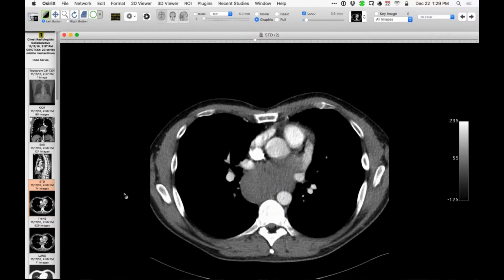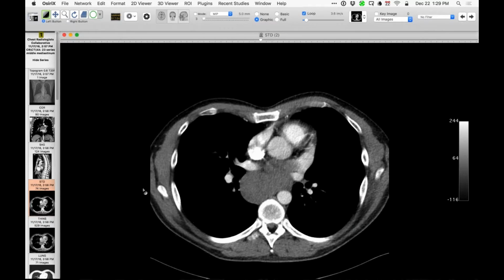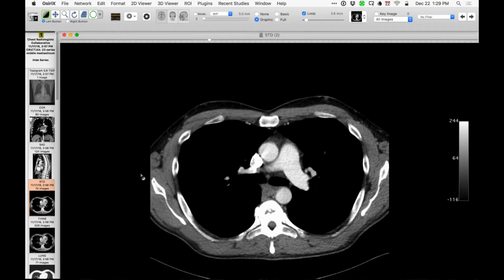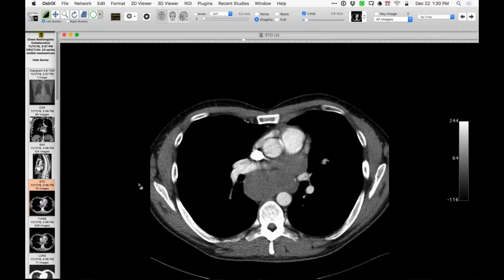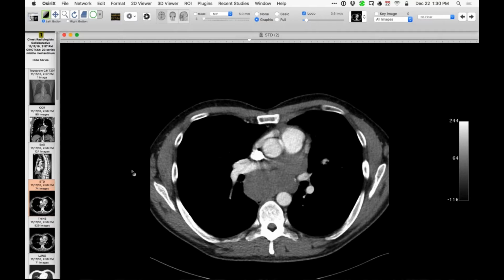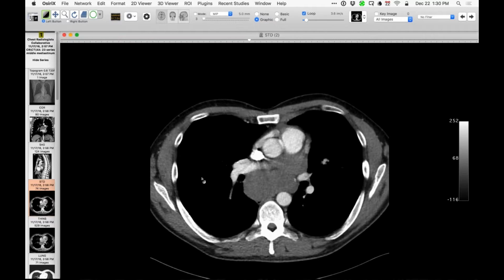Can you scroll to the mass again, Howard? Just the initial. Okay, so this is the initial one. Yeah, there we go. It looks pretty well circumscribed there. Yeah, it goes up pretty high. We're talking about going towards the left pulmonic recess. Do you guys routinely get MRs for these if you think it's a proteinaceous cyst in this location? I'm certainly thinking about doing that more often when you get those higher numbers and it still looks like a cystic lesion, well circumscribed, relatively low in attenuation, maybe a little lower compared to muscle, but you do wonder, don't you?